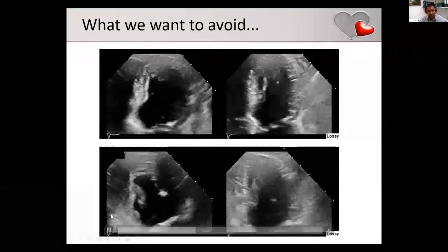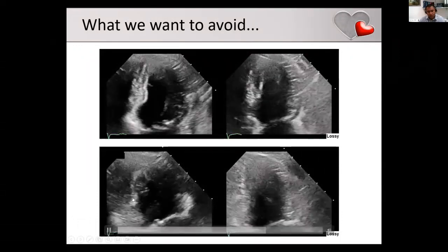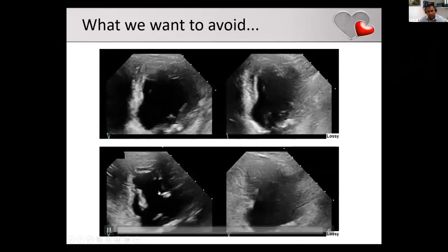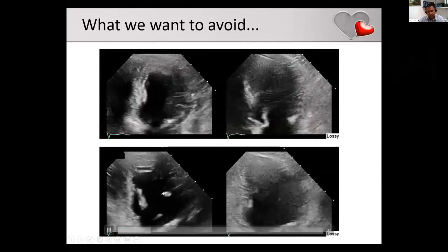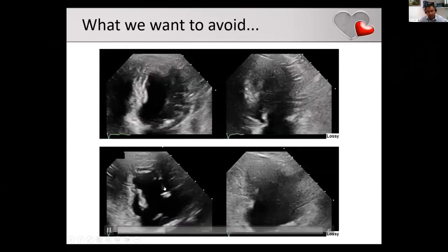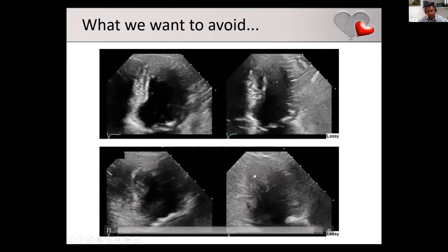And then if we have a look down here, this is the 2-chamber view in the same patient. Again, highly foreshortened. Inferior wall just about seen, anterior wall not well seen. Remember, there's a papillary muscle here and a papillary muscle here. So you cannot be sure that's endocardium. It's almost certainly pap muscle. Where is the anterior wall here? And then have a look at peak stress. I mean, really, what are you diagnosing here?